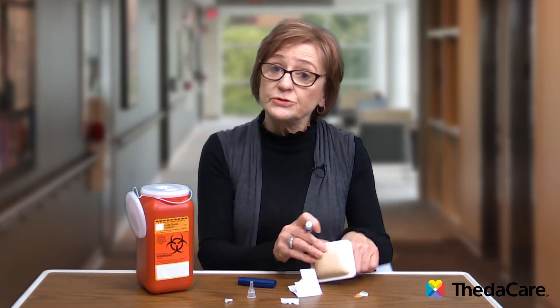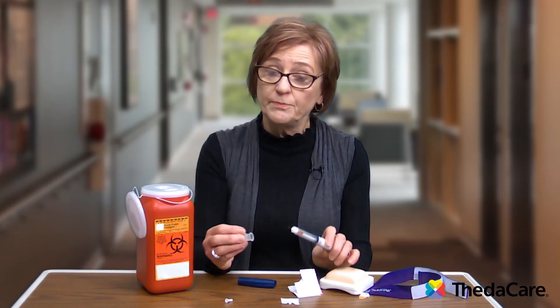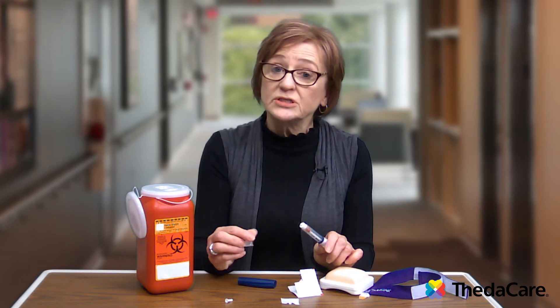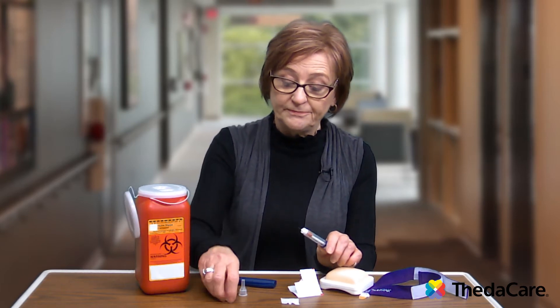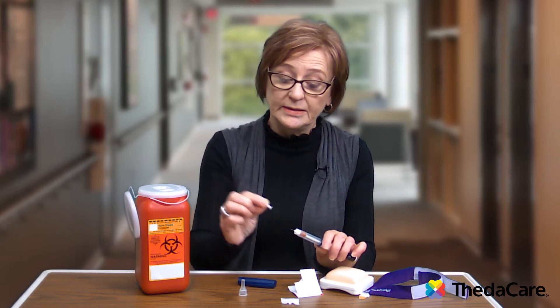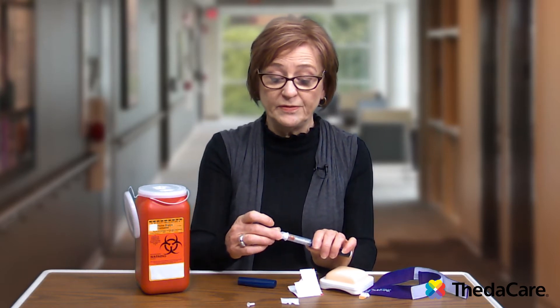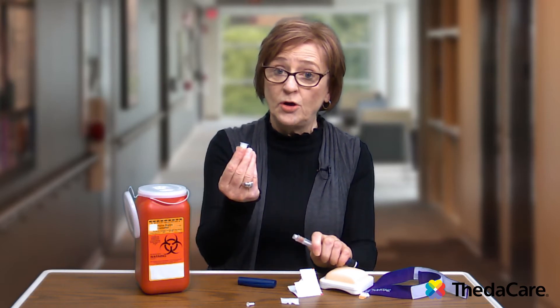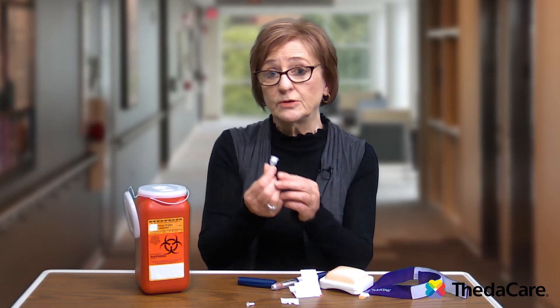Once you're done with that injection, you're going to want to dispose of the needle. To take the needle off the pen, don't bother with putting the small inner cover back on — take the outer cover that came with the pen needle, place it on, unscrew it, and pull it off. This is what needs to go into a specially marked sharps container.